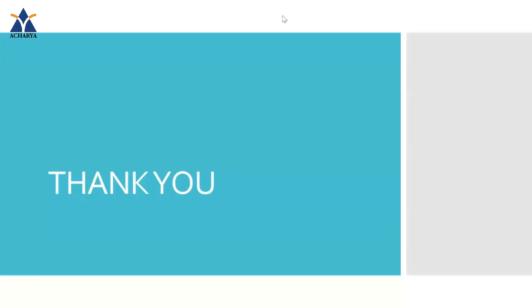What is chemical shift? Chemical shift means the change in the frequency or Larmor frequency of your metabolite because of its chemical makeup, the functional group attached with your metabolites, and the chemical environment of your metabolites.